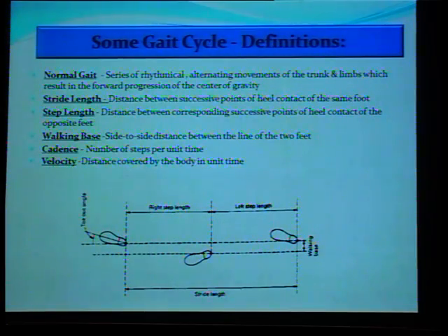Arrhythmia is unusual; it's where you have tachycardia or ventricular tachycardia, stuff like that. The same way, you are looking at rhythmic walking patterns. You are looking at your trunk and limbs, how they work in tandem to keep your walking going. This is a normal gait that you are looking at.